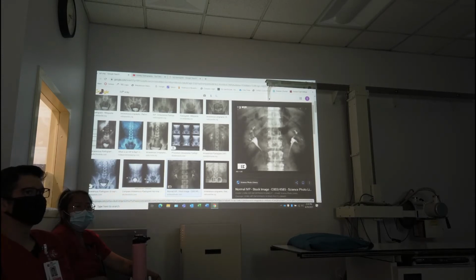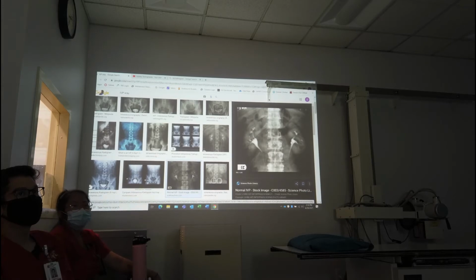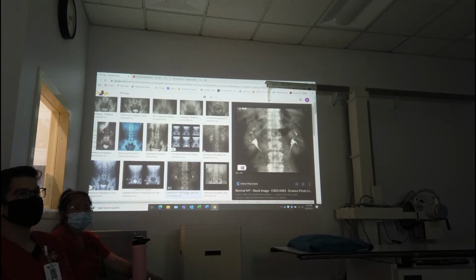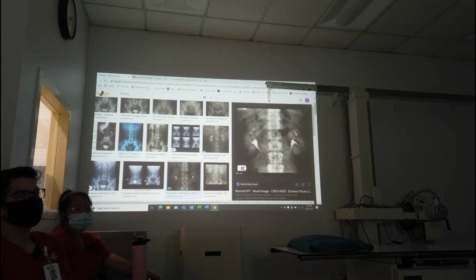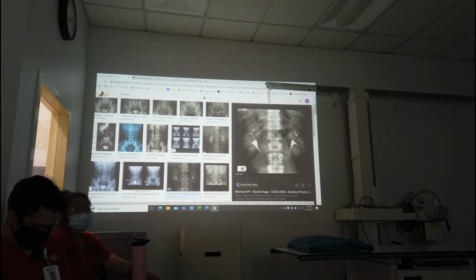You don't have any radiologists on staff right now? No, they all have to take off at lunch around 12 o'clock. They're usually back by 1:30 though. I was like, ooh. You cannot do intravenous contrast injections without a physician on site. They have to be on site. So it's a big no-no.